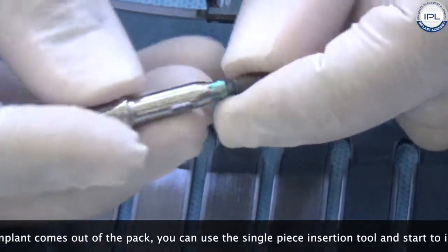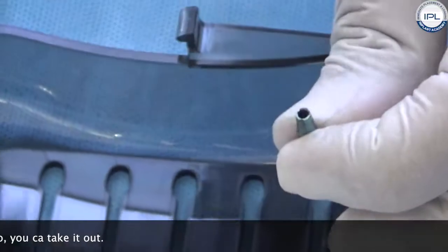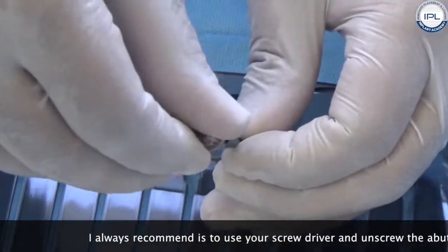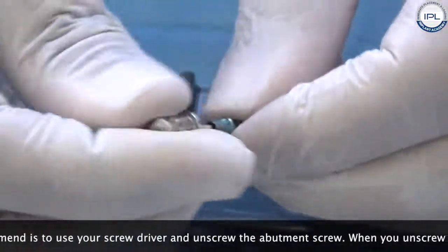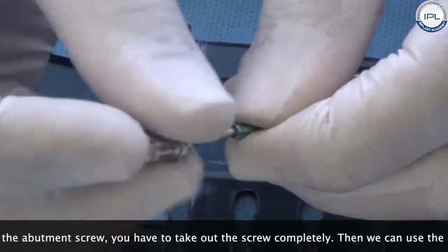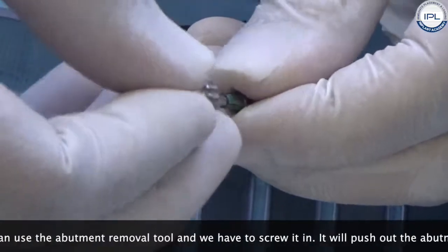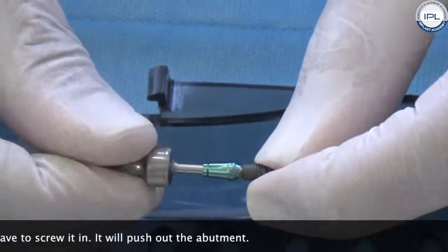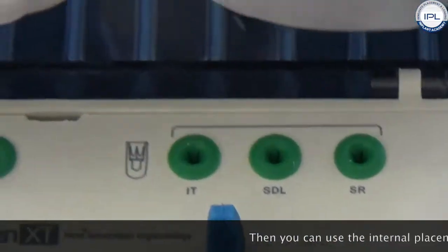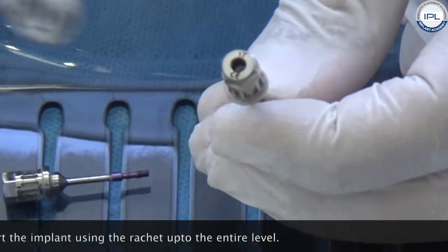Once you insert the implant by hand as far as it will go, you can take the insertion tool out. What I always recommend is to use your screwdriver to unscrew the abutment screw completely. Then use the abutment removal tool — screw it in and it will push out the abutment. After that, you can use the internal placement aid and insert the implant using the ratchet up to the full desired level.